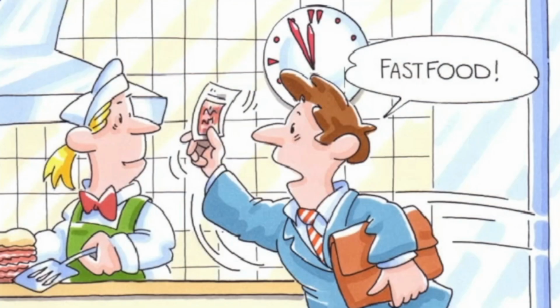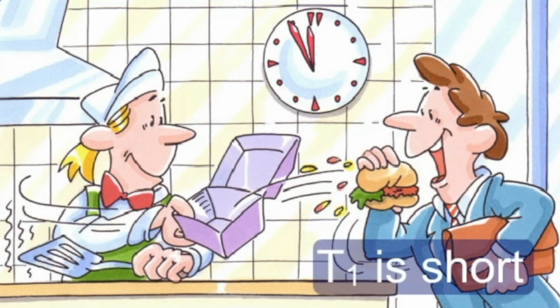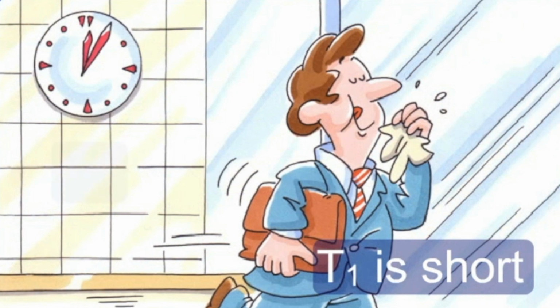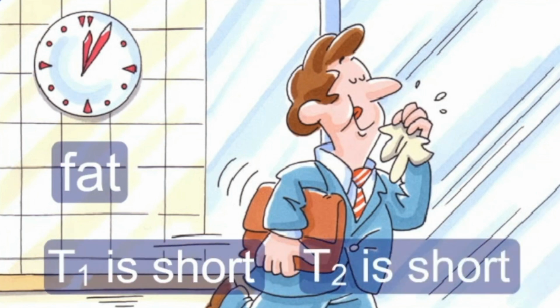Now, look at this gentleman getting a hamburger. These normally contain much fat and will represent fat for us. The hamburger is fast food. You get it fast. Thus fat has a short T1. What about T2? It takes some time to eat fast food, fat. However, you normally spend more time with your long drink. So, fat has a shorter T2 than water.